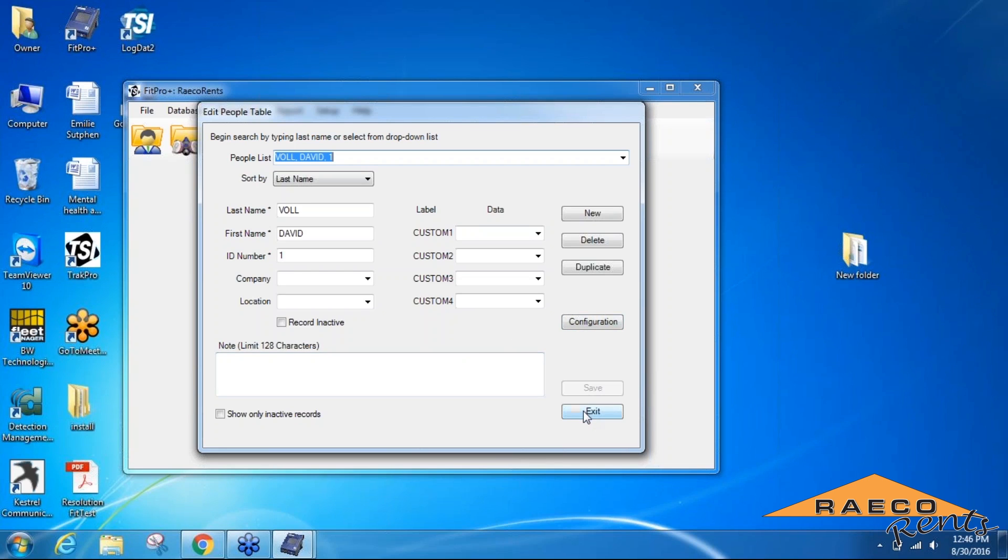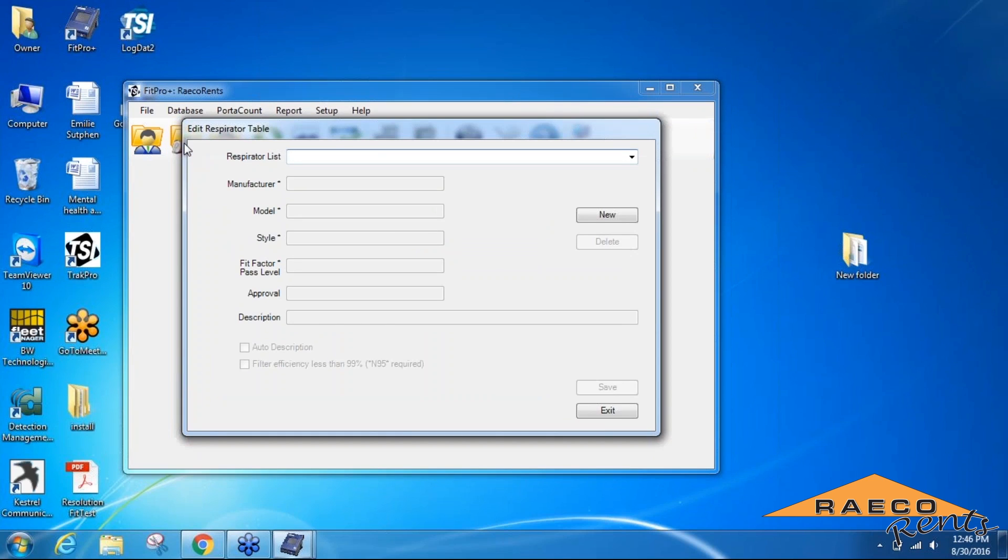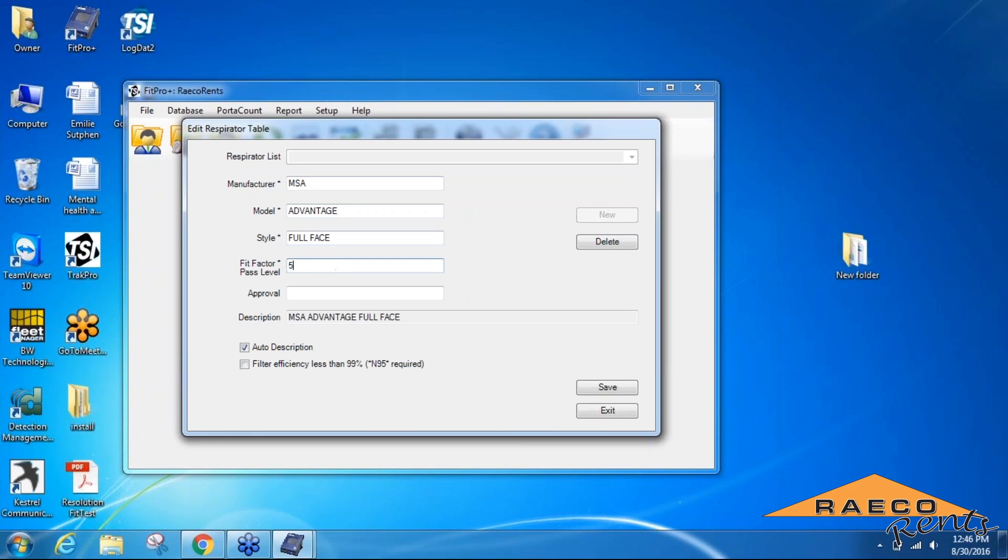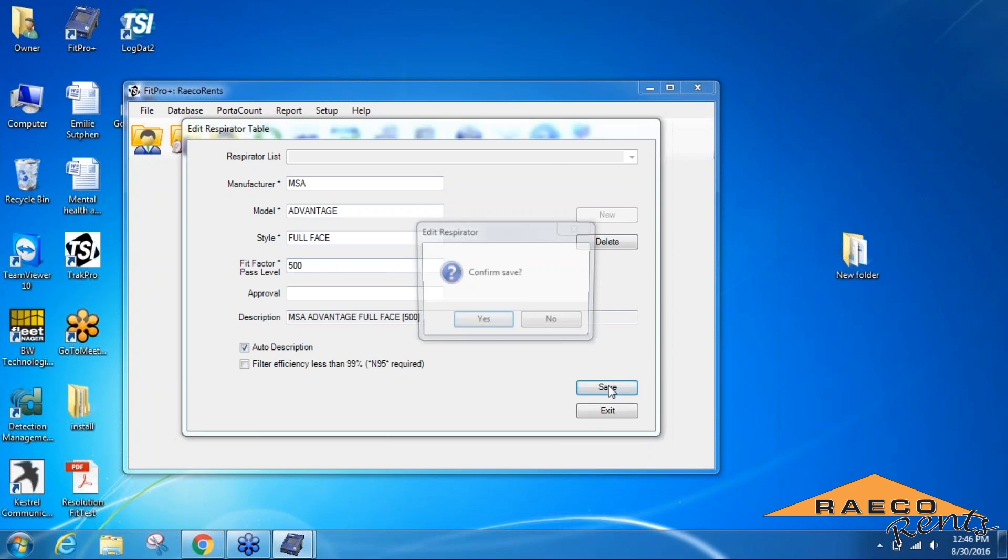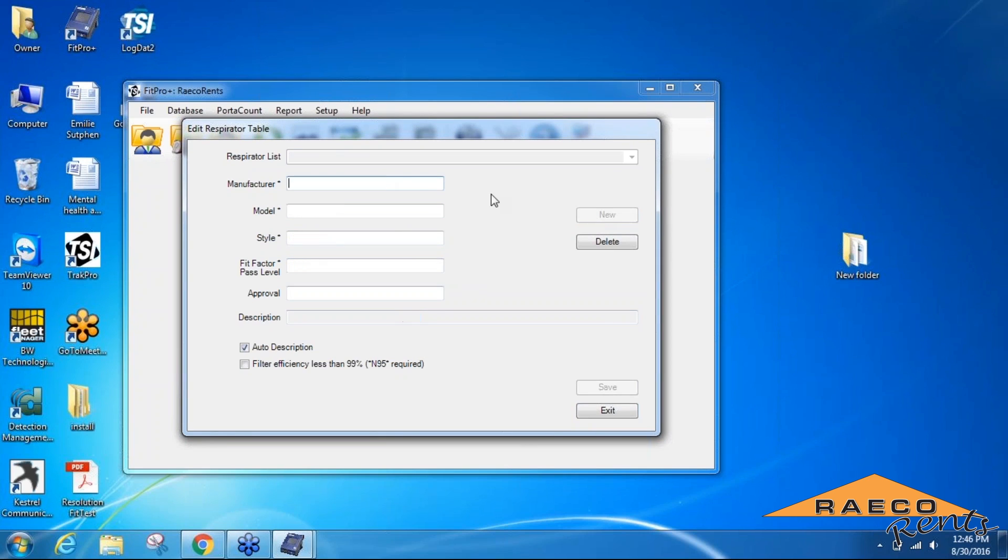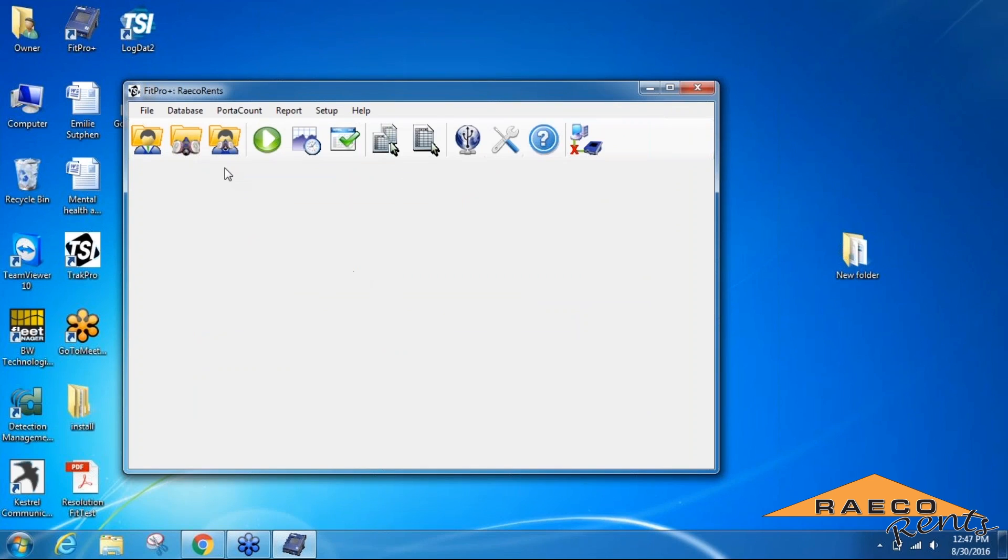It's the same process for that. We'll create a new respirator - MSA - and usually for a full face respirator it's a 500 pass value, so we'll use that. Again, if you're going to be doing more than one respirator, you can add those in as well by clicking the new button and adding those in.